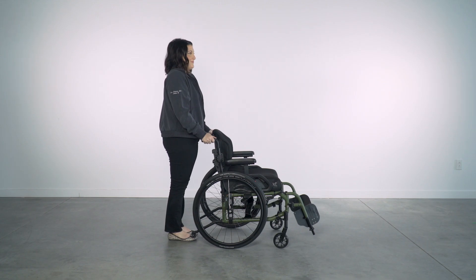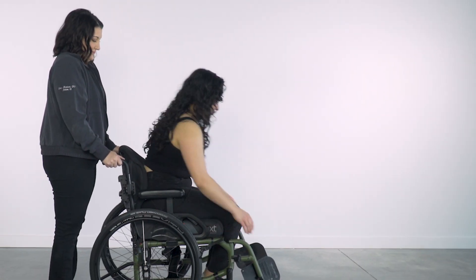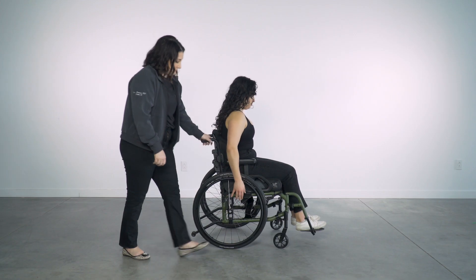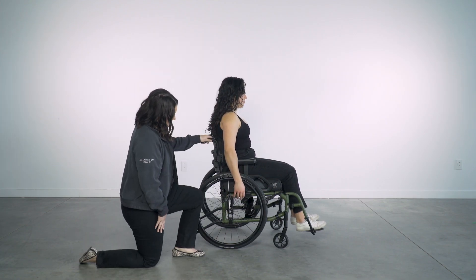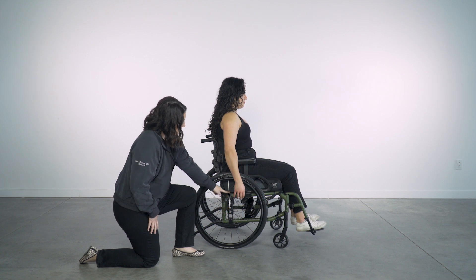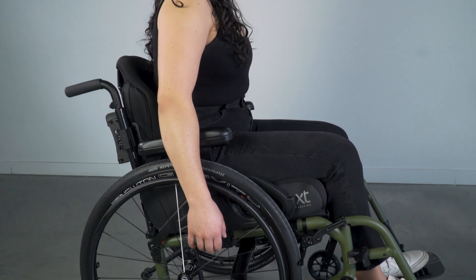Now let's go over how to perform a quick ideal check when a client is sitting in the wheelchair. I will invite my colleague to help me with this demonstration. Have your client sit comfortably upright with their arms down at their sides over the rear wheels. You will want to pay attention to the center of the axle and use a spoke to help you draw that imaginary plumb line straight upwards.